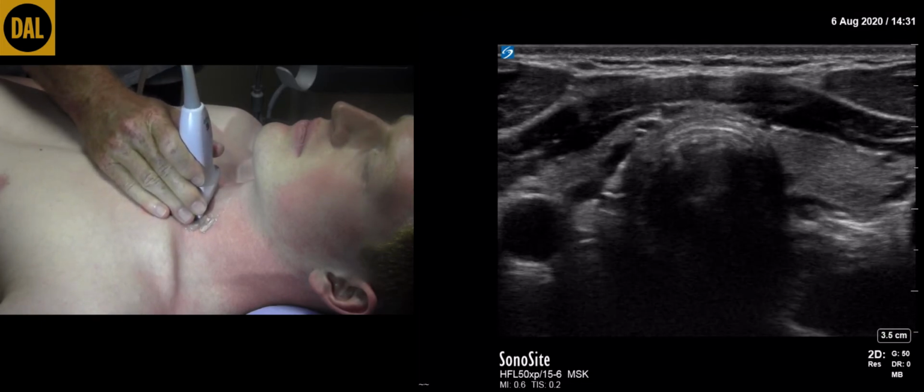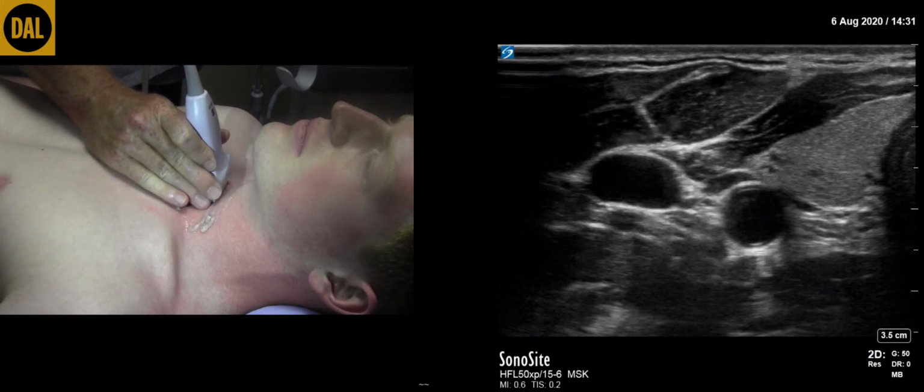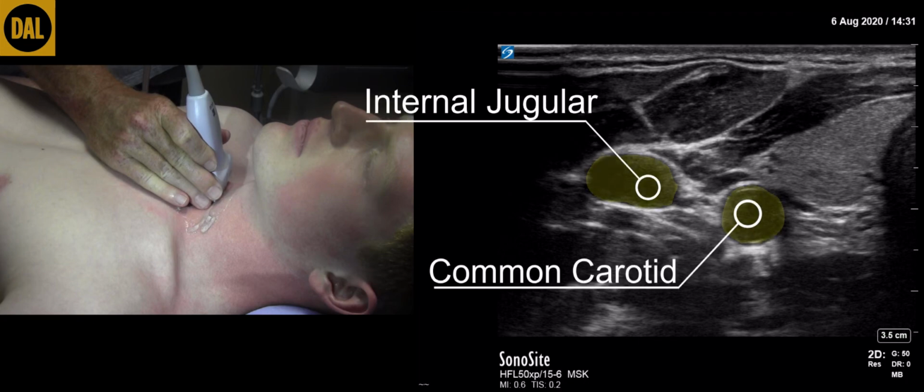Next, slide the transducer to the patient's right and again identify the internal jugular vein and common carotid artery. This completes the scan of the anterior neck.